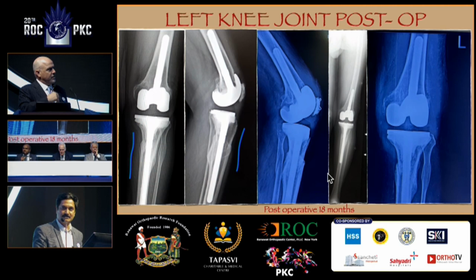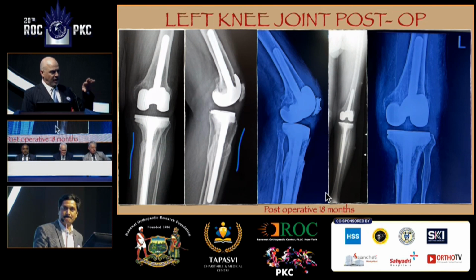For the patella fixation, the patella was fractured, and you have done wiring. Do you have a Merchant view? Skyline view? So the wires, you show the slide, you have wire inside, right, on the patella side, the femoral component side. So what are they doing there? You're worried about the wires hitting the trochlea? Yes, correct. So no option left to fix the fracture. The wires are on the undersurface of the patella?